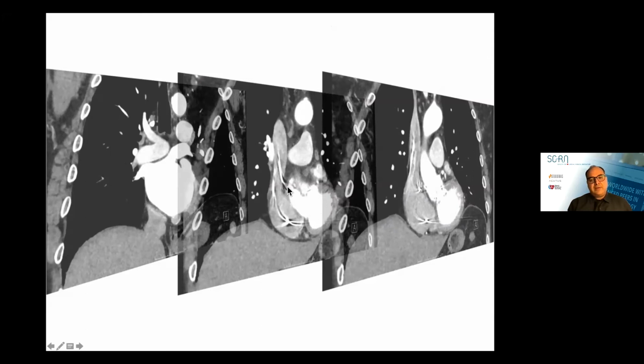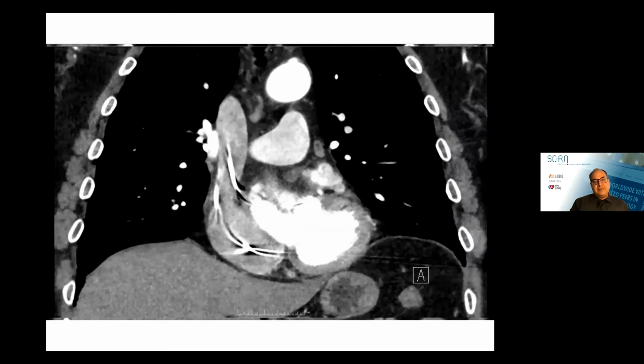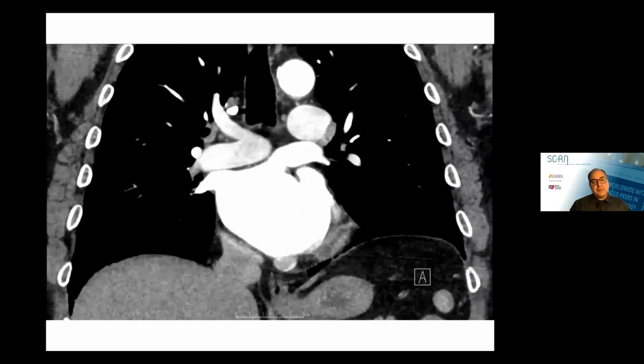As you go back, you see that the left atrium will start to appear here, still predominantly showing the SVC, and the aorta gradually disappears. At the level where you probably want to go transseptal, where you see pulmonary veins, there is no view of the SVC, and usually not much of the aorta is seen. So that is sort of confirmation, and this is another way of looking at it essentially. This is the front where you have the aorta. This is the mid portion where you start seeing some of the left atrium, and this is the posterior where you see all the left atrium but no aorta.